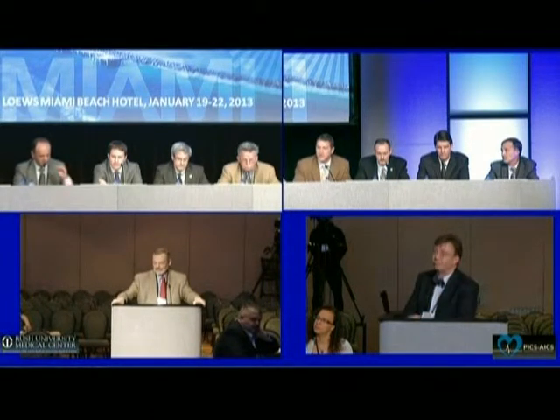Whereas what Dr. Carroll showed, and working with Seibel and the guys at Cedars, I've been witness to a number of complex mitral procedures for moving structures like the mitral valve, or like rapid flow through ventricular septal defects and the way the interventricular septum changes. I really think that they're on to something much more with echo than we are with RA. I don't think that's going to be the answer.